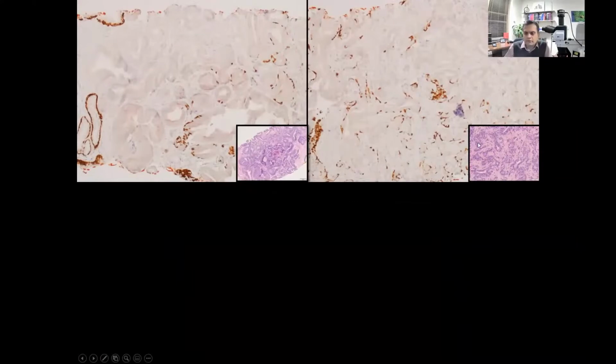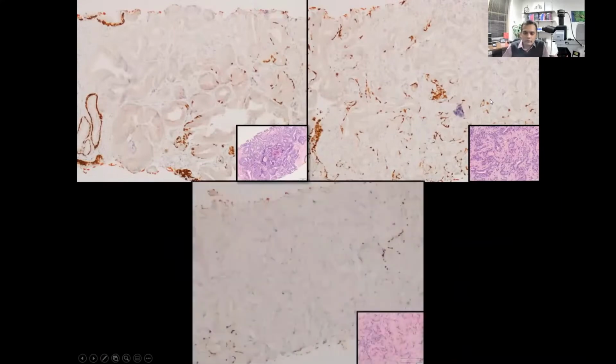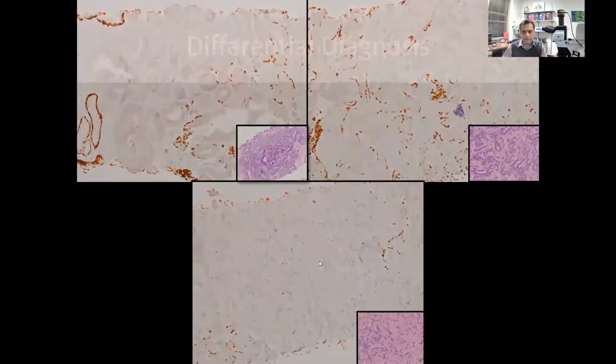If you move further towards the left in that core, you can again see many of the glands retaining the basal cell stain, whereas in the left corner, most of them seem to have lost it. And then if you move towards the far left, where we saw all those ill-formed glandular structures or no glandular formation at all, a vast majority have actually lost the basal cell staining.